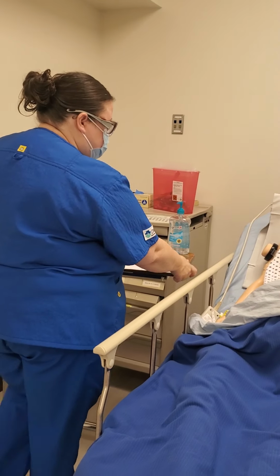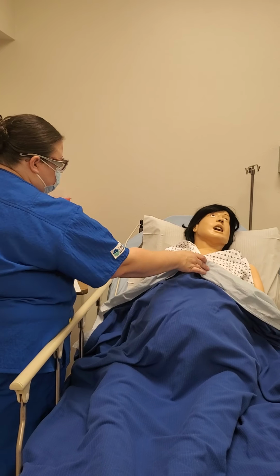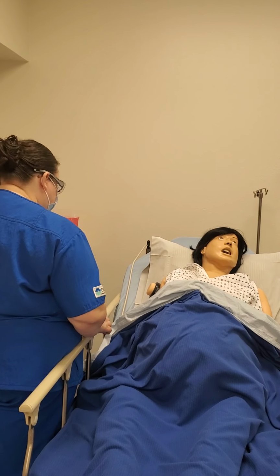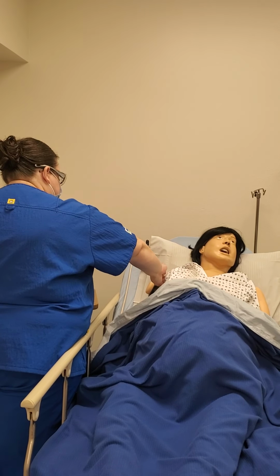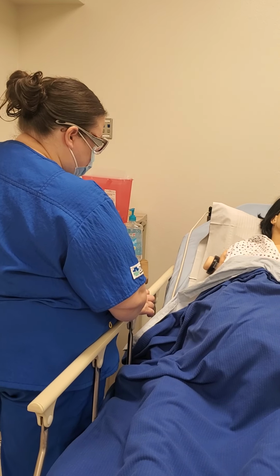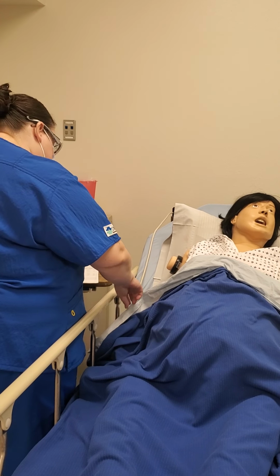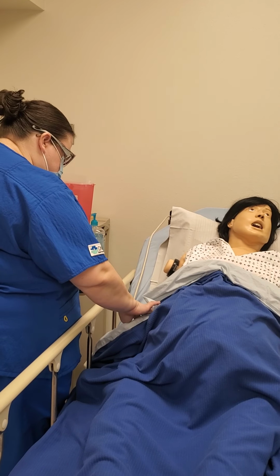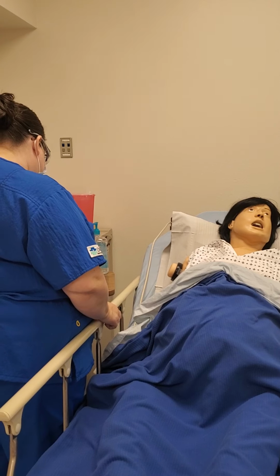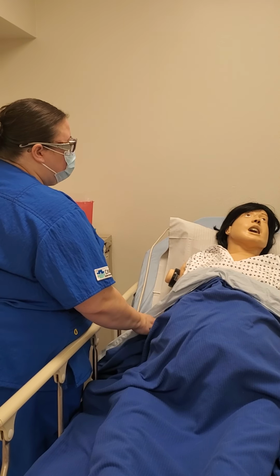Hi Shirley, I'm Tara and I'm a student nurse, and today I'm gonna be administering 2 injections. One is gonna be here on your arm, 3 fingers down from your acromion process. It's an intramuscular injection and it's for nausea, and it's called Phenergan. And then I'm just going to check your bracelet here to verify. Your name is Shirley Cost and your date of birth is 4/3/1987. Is that right, Shirley? Okay.